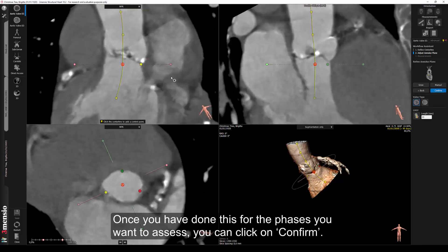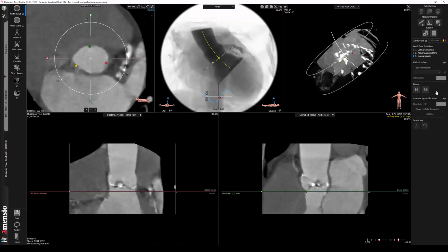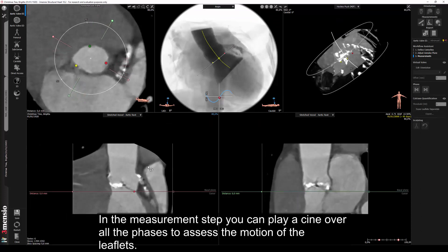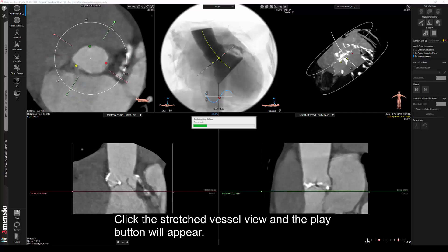Once you have done this for the phases you want to assess, you can click on confirm. In the measurement step you can play a cine over all the phases to assess the motion of the leaflets. Click the stretched vessel view and the play button will appear.